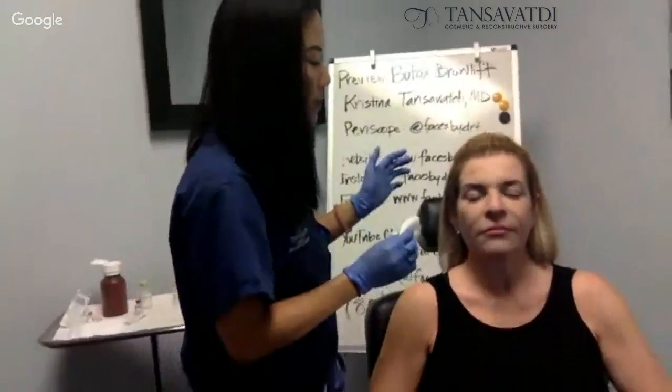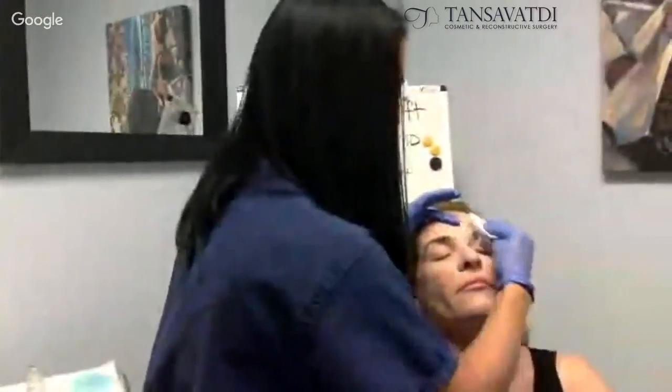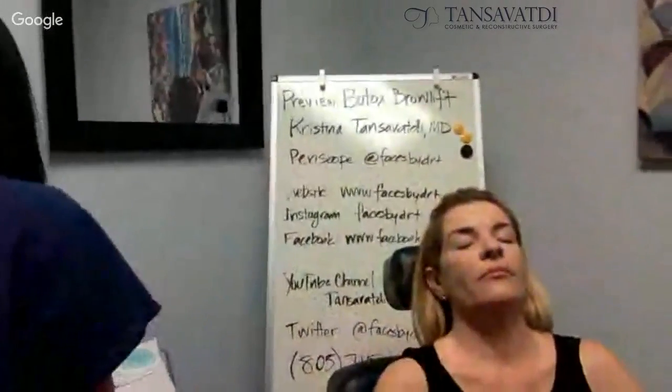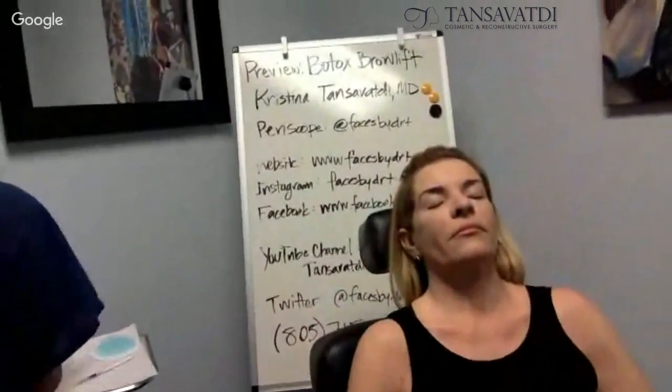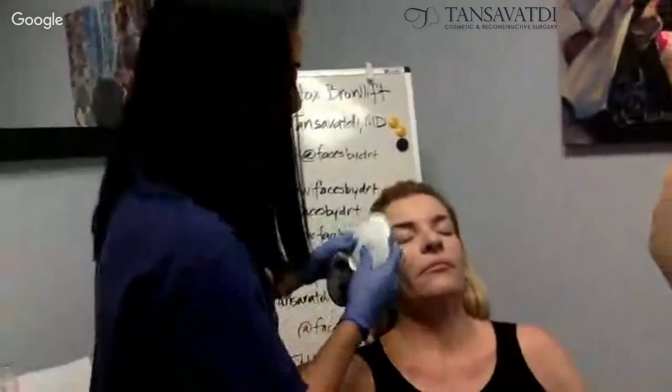Rest your head back. I'm going to alcohol the sites that we're going to do the injection. Sometimes I use ice packs too, to kind of numb the areas. I like to do this procedure with the person lying back, but for the purposes of the video, we're going to do this today with just her sitting up.